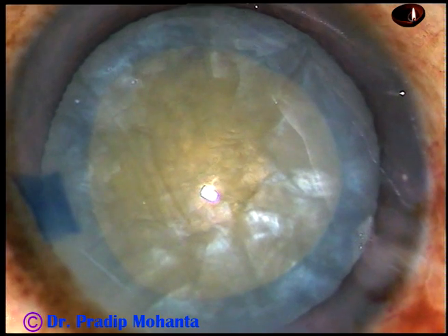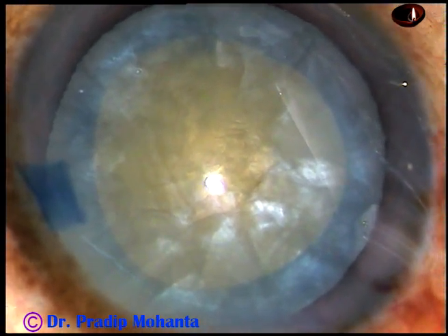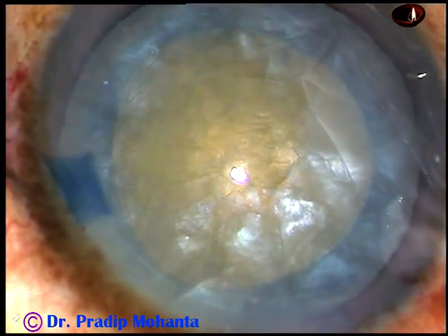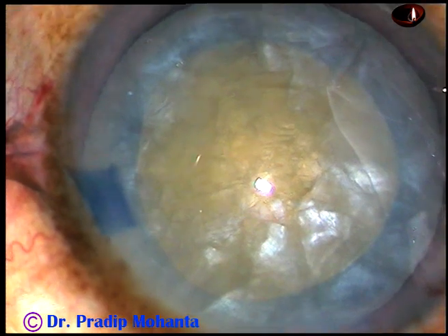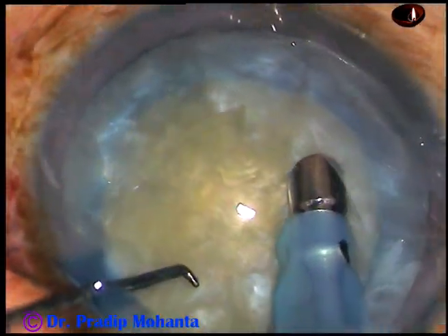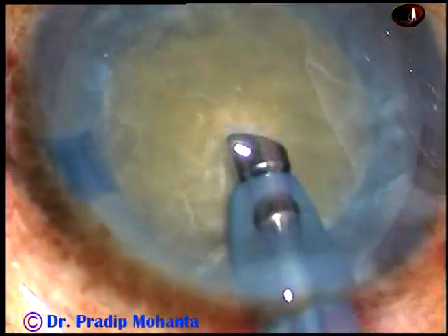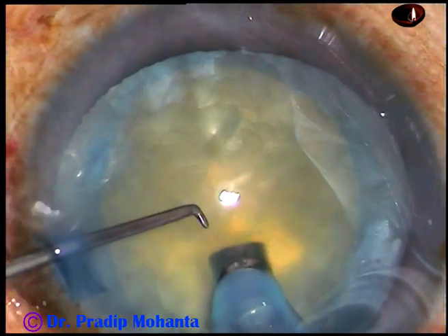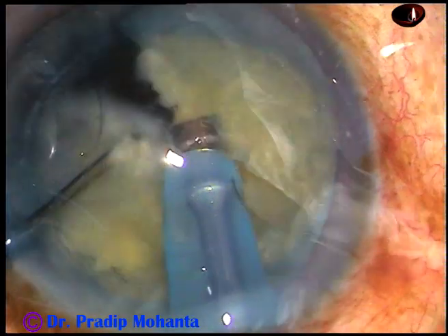And now, the handpiece is introduced into the anterior chamber. The machine being used is Oertly Cataract-3. 2% HPMC has been injected into the anterior chamber. Now, the tip of the phaco handpiece is introduced and beveled down. Some superficial lens matter is removed. The handpiece is turned. Now, watch direct chop — bury the tip completely into the substance of the nucleus, hold the nucleus firmly and chop it.